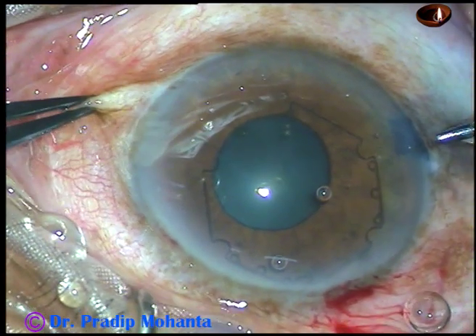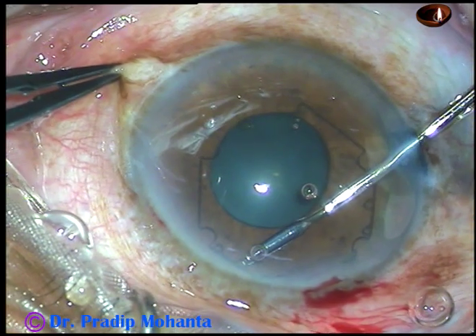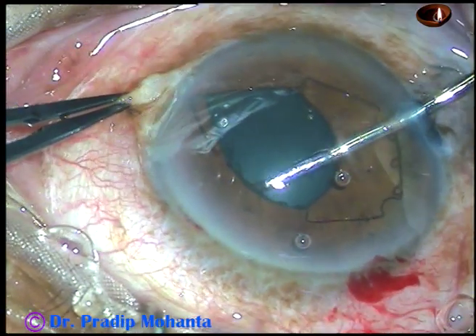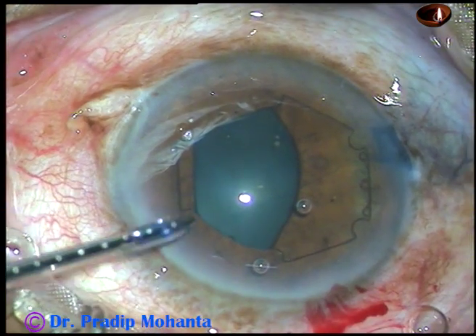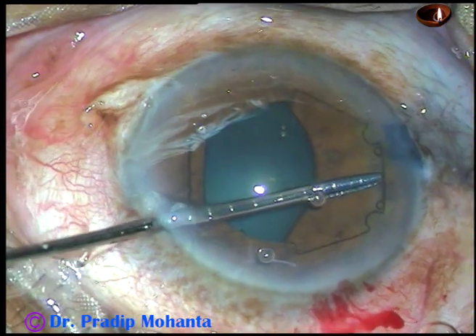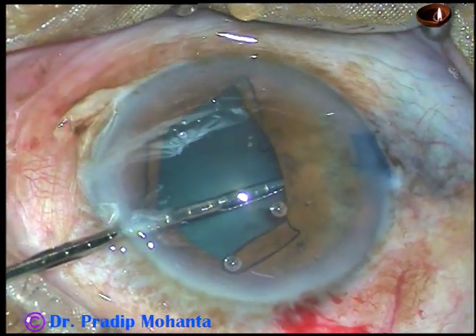Now, you go through the right side port or through the main port. The flange on the left side, centered at around 1 o'clock, is tucked in this way. Then I go through the left side port, and with the help of the left hand, the flange on the right side, centered at around 9:30, is tucked in this way.